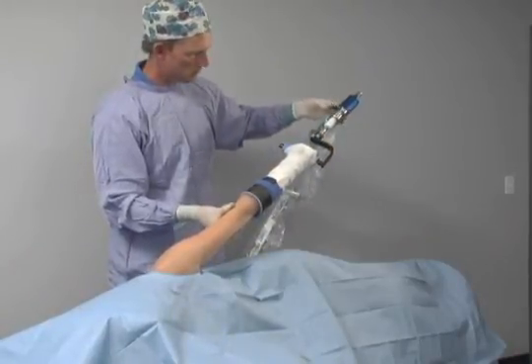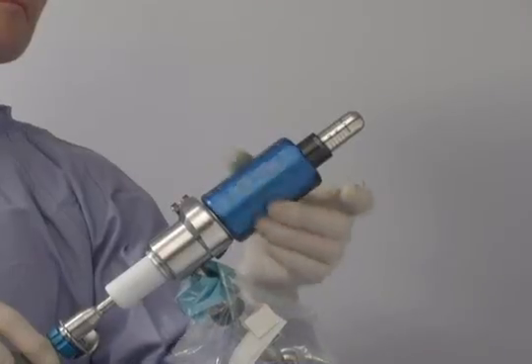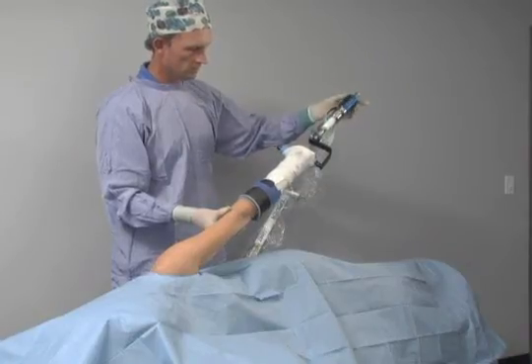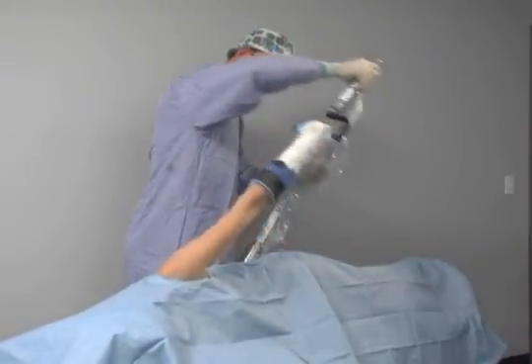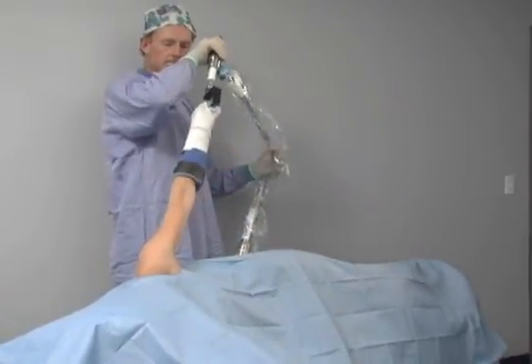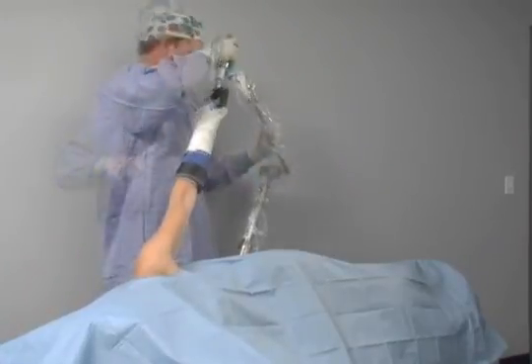In order to use the traction collar properly, the collar must be zeroed by rotating it to its bottom position. The 90 degree connector provides the ability for the surgeon to adjust the internal and external rotation during the case, but does not allow adjustment or measurement of the traction.